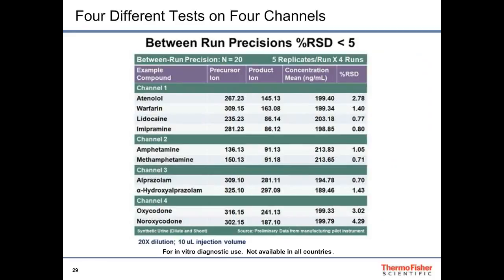Each channel produces results for individual analytes as we run 4 different methods simultaneously on the Prelude LX4 MD HPLC with Endura MD mass spectrometer. We typically get precisions less than 5% RSD with these performance tests that you see here.